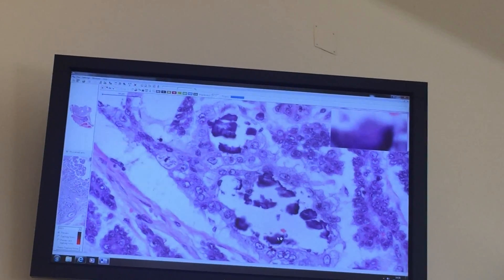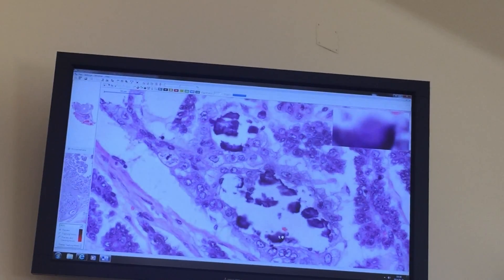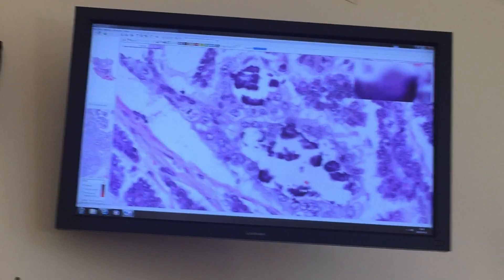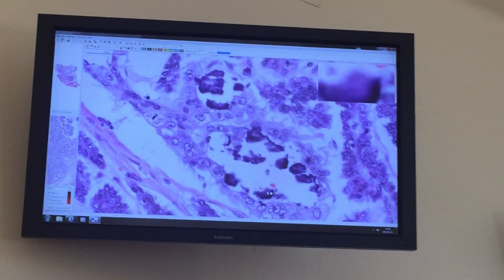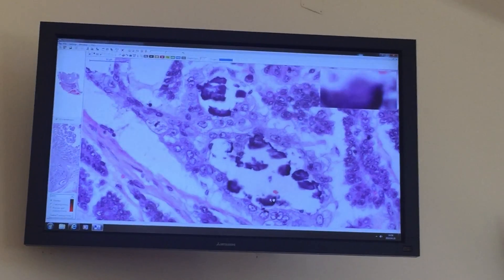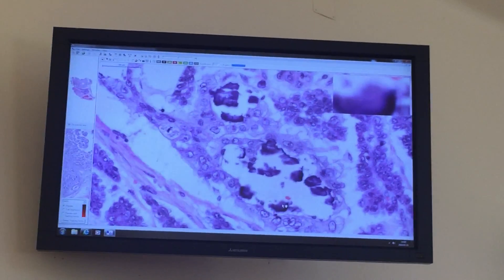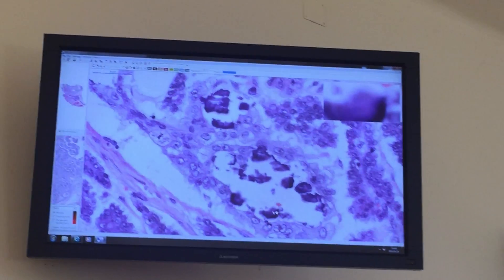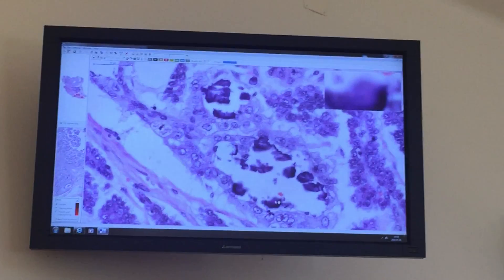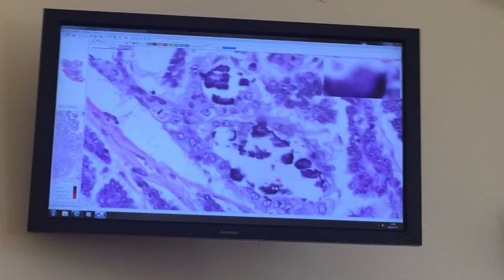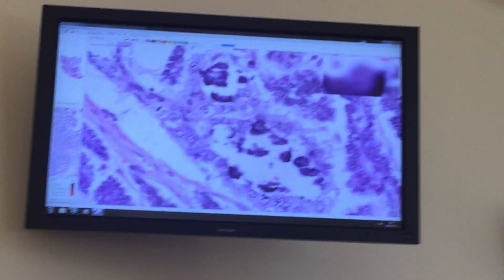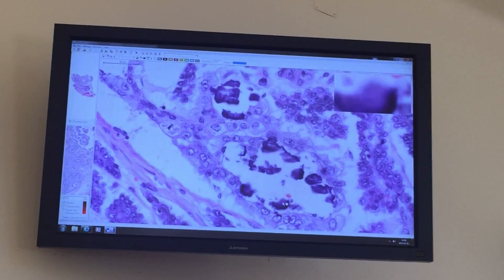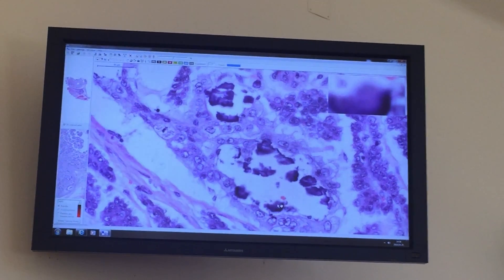Psammoma body — this is seen in meningioma and in papillary thyroid carcinoma. So concentrically laminated calcified body.